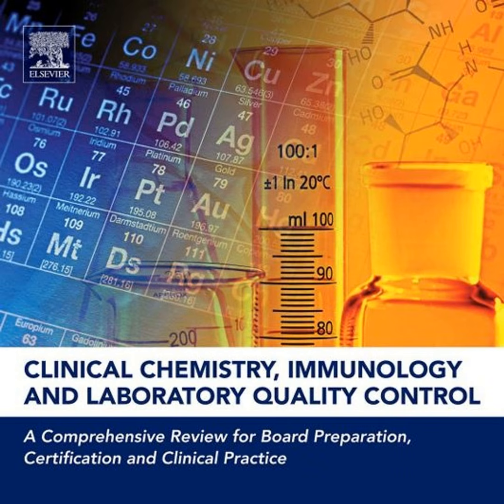What about screening for monoclonal gammopathies? We use serum protein electrophoresis, SPEP, but what's the definitive test? SPEP is a great screening tool. It separates proteins into 5 fractions. If a localized spike is detected in the gamma region, a monoclonal protein, then immunofixation is the required definitive confirmatory test. And that tells you the specific type. It identifies the specific isotype, like IgG, IgA, or IgM, and the specific light chain, kappa or lambda.